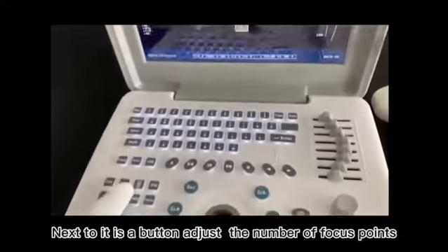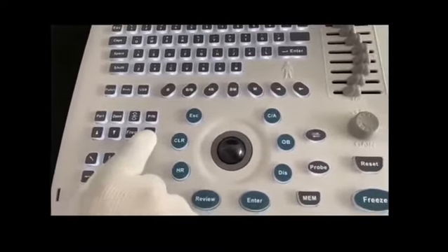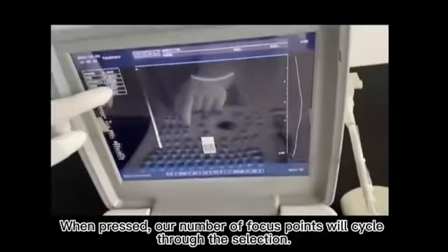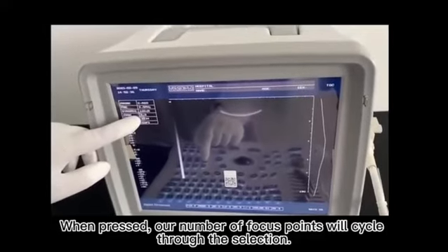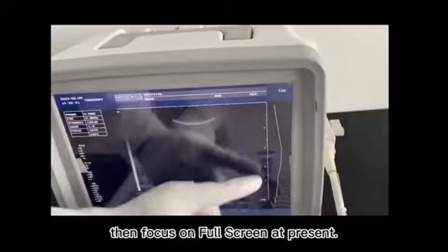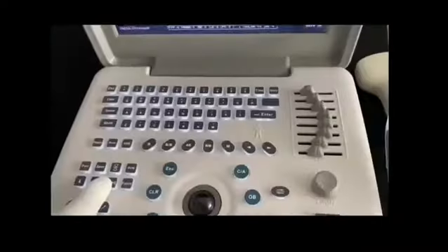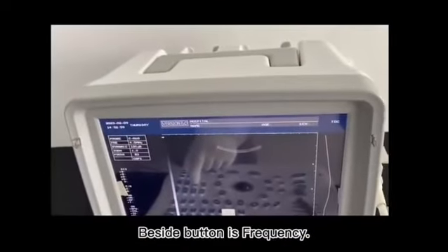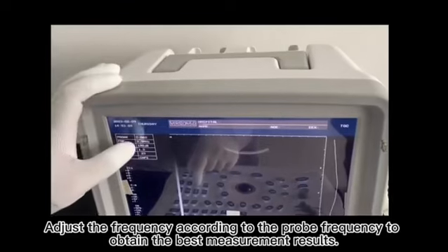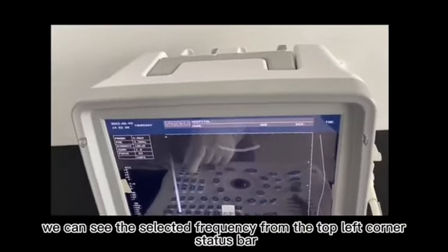Next to it is a button to adjust the number of focus points. When pressed, our number of focus points will cycle through the selection. Then focus on full screen at present. Next button is frequency. Adjust the frequency according to the probe frequency to obtain the best measurement results. We can see the selected frequency from the top left corner status bar.